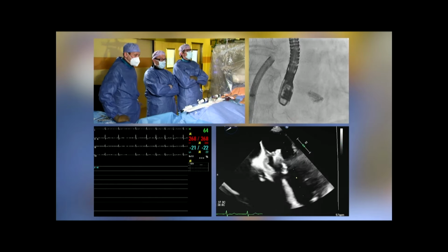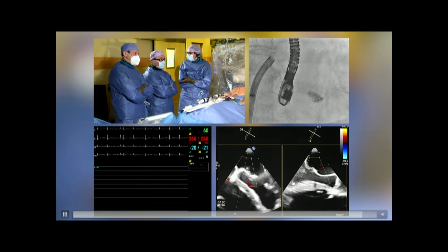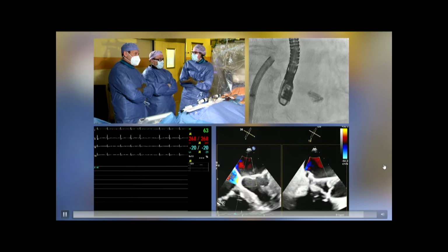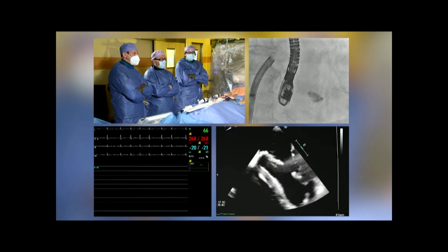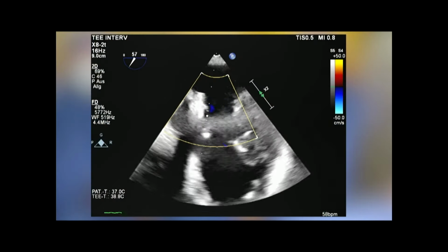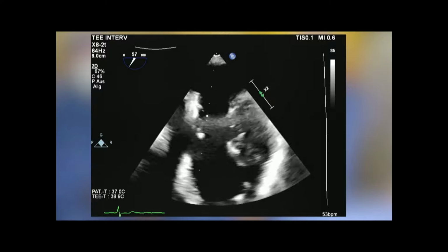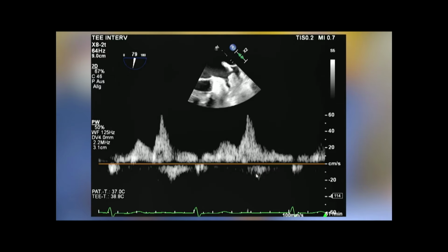What's the degree of MR now after release? Maybe we should discuss that. I mean, treatment goal, because we all agreed it should be mild or less in these patients. Moderate is not acceptable anymore. I would say it's moderate, because I've recorded that. You still see a little bit the systolic wave in the pulmonary vein lower than the diastolic, and it's on the right as well as on the left.